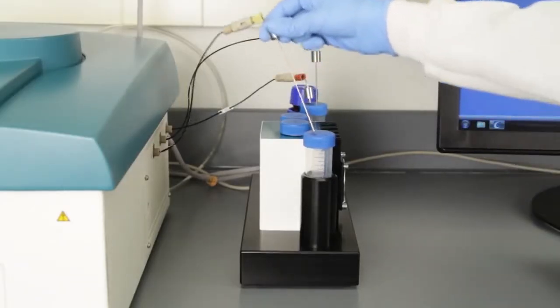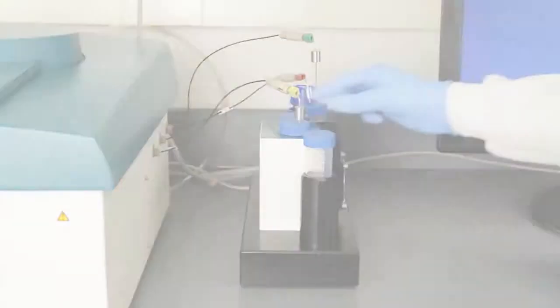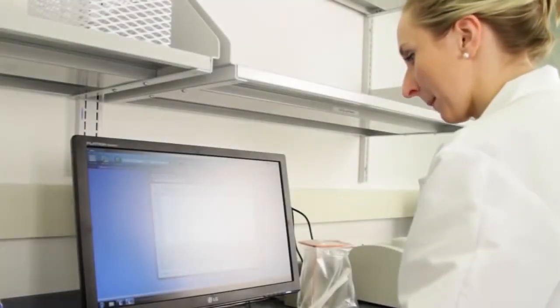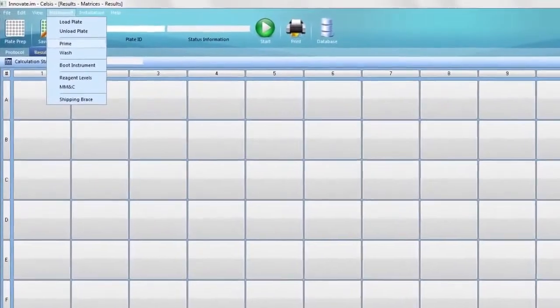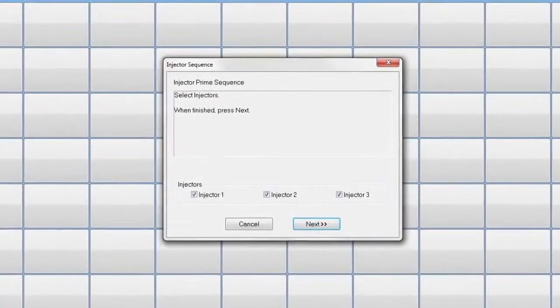Transfer the injectors from the wash vials to the reagent vials. Click Instrument Prime. The clear on-screen instructions guide you through the priming process.